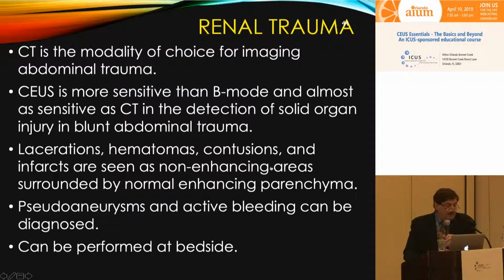For renal trauma, obviously CT is usually the modality of choice for abdominal trauma. CEUS is more sensitive than B mode and almost as sensitive as CT in the detection of solid organ injury in blunt abdominal trauma. Lacerations, hematomas, contusions, and infarcts are seen in non-enhancing areas surrounded by normal enhancing parenchyma, and pseudoaneurysms and active bleeding can be diagnosed. And more importantly, this can be done at the bedside.